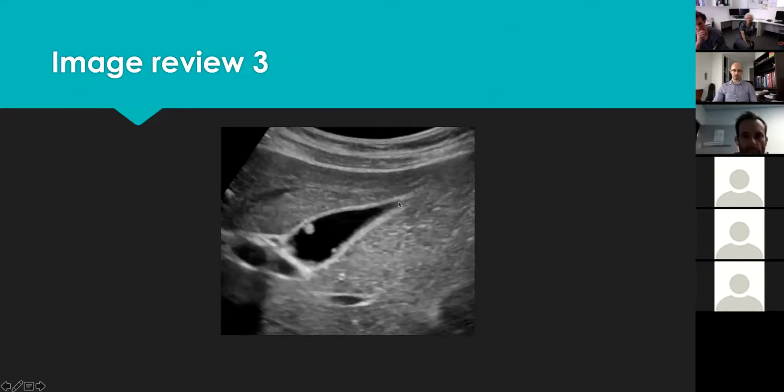Excellent. And that's another example where you can see the gallbladder wall when it is perpendicular. The area that is perpendicular is actually narrow, less than 3 just by eyeball. But in this area, because it's a bit horizontal, just cutting the ultrasound beam in a horizontal way, it's actually smeared out.